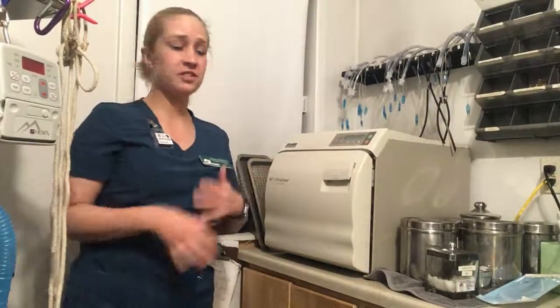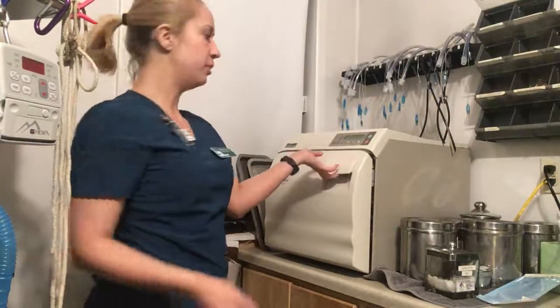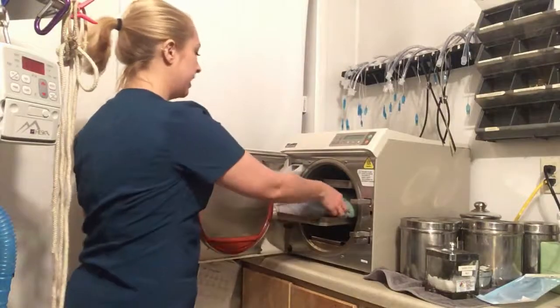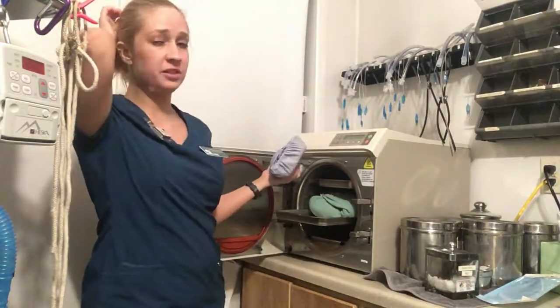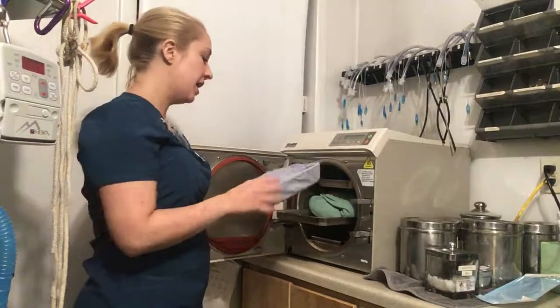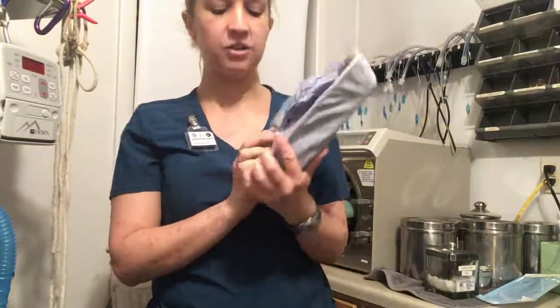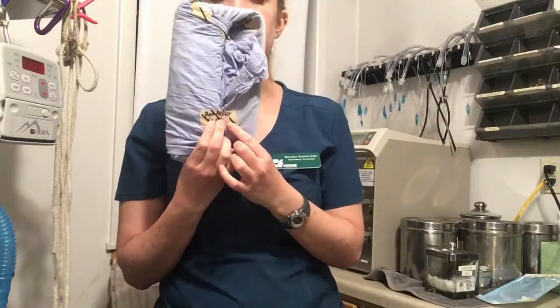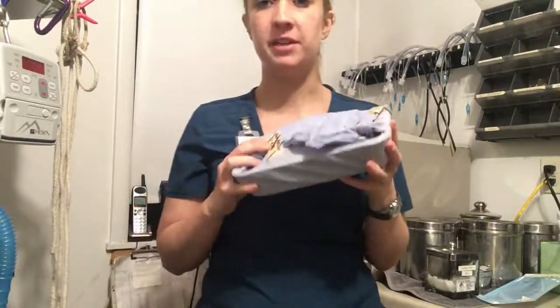Alright, so now that our sterilizer has run through and everything that we just packed is now sterile, you can double check to make sure everything is sterile. Also, side note, make sure that everything is cooled a little bit before you take it out, or else it could be really hot and you could burn yourself. And like I said, once you take it out, you want to double check your indicator tape and make sure that it has these black lines like I've mentioned before. Really make sure that it is properly sterile before using it in the future for surgeries.